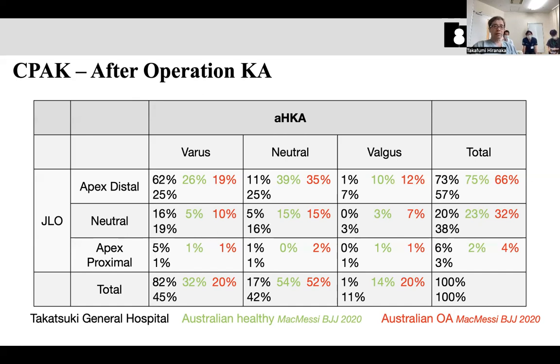We need to consider that varus alignment with apex distal is more prevalent in Asian patients, so we should be careful in accepting the concepts from Western people. Sometimes we accept the true kinematic concept naively to perform this. Then many patients have very extreme alignments after the operation, such as too much MPTA, too much varus. So we should construct our own protocol for kinematic alignment.